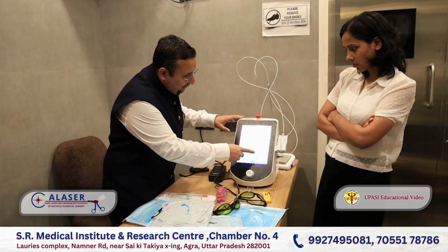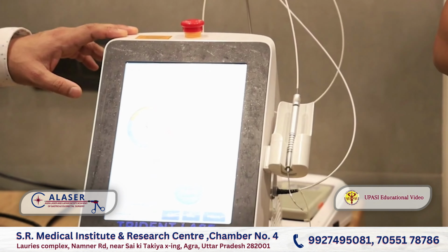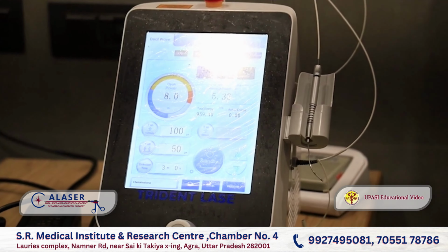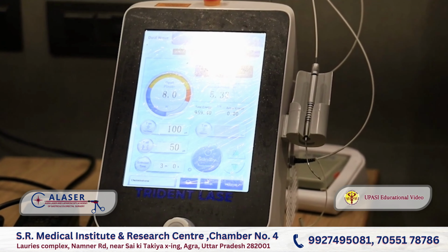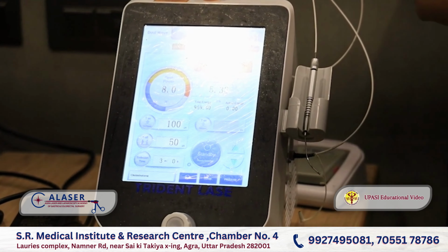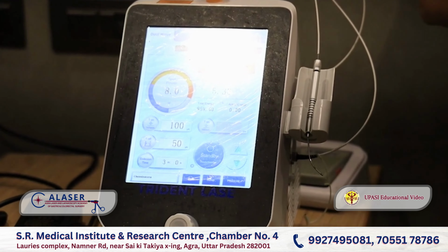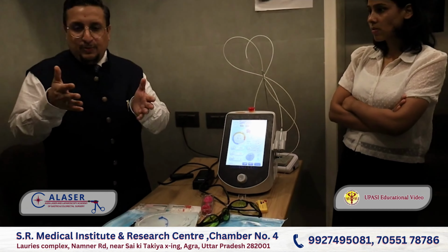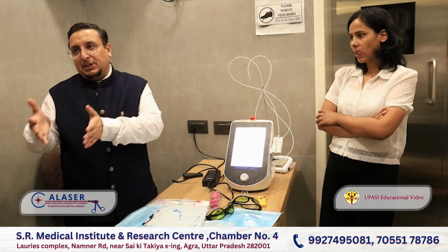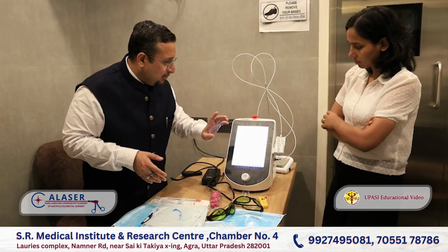Then these are the settings. This is the button for this. I told you two modes. Which two modes did I tell you on operating? Continuous mode and pulse mode. In continuous mode, energy will be going in one way only. In pulse mode, energy will go, then it will stop for a pause, then it will go, then it will stop for a pause. So we have two modes: pulse mode and continuous mode. I will be telling you which surgery will be done in pulse mode and which surgery will be done in continuous mode. So these are the continuous mode and pulse mode, right?